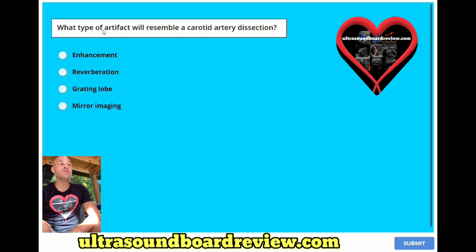Question 16. What type of artifact will resemble a carotid artery dissection? A, enhancement, B, reverberation, C, grating lobe, or D, mirror imaging? The answer is B, reverberation.